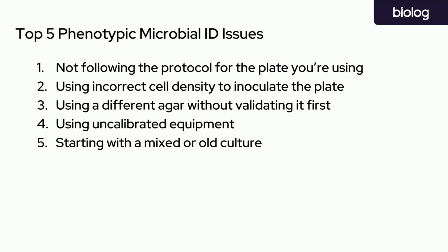There's number 5 here, starting with a mixed culture or an old culture. Can you talk a little bit more about the mixed part of it first? How do I know if I have a mixed culture or not?